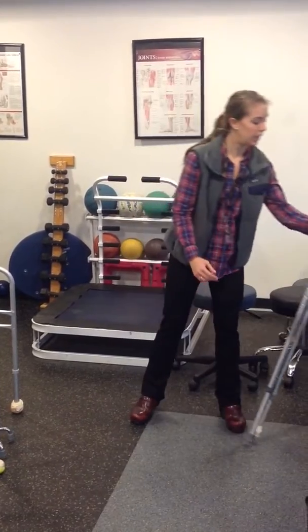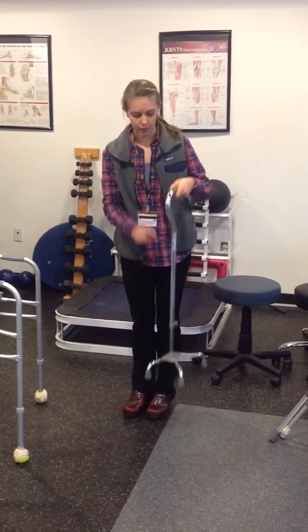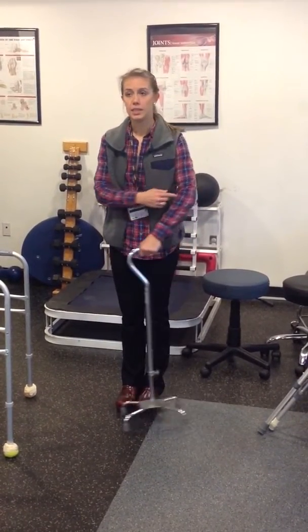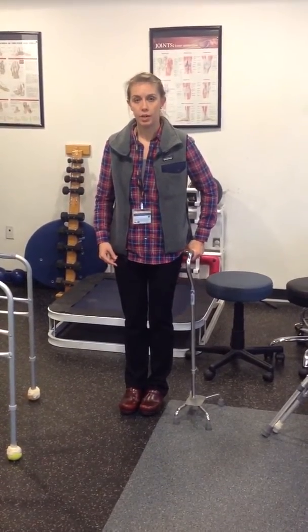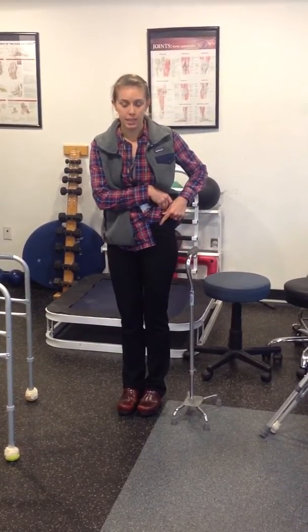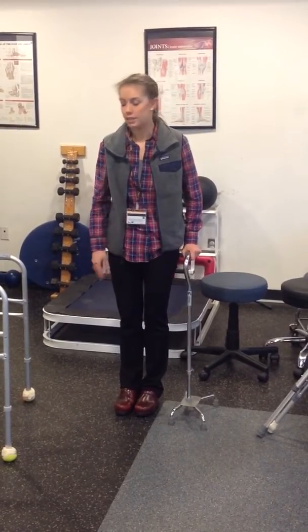For a cane and a walker, it's pretty similar. This is a quad cane, but it's the same for a single point cane. You want to have that same 10 to 15 degree bend in your elbow, and then it should hit at about your hip joint — which is kind of if you come to the side of your hip here, you'll feel a hard bump. So it's not up at the top, but down on the side of your hip, that you should feel right where your hand hits.